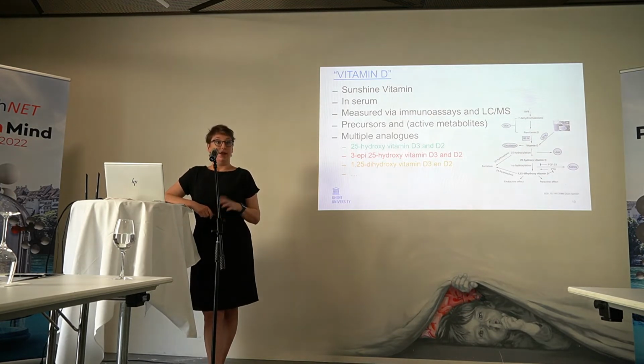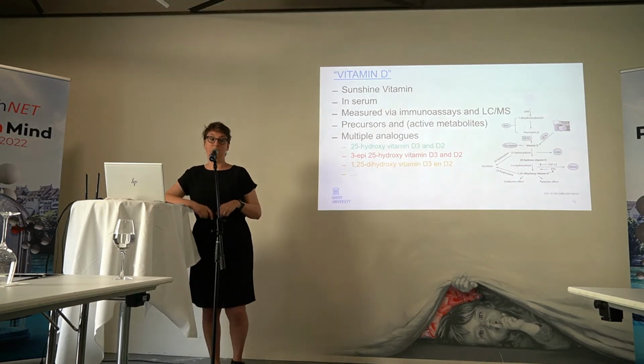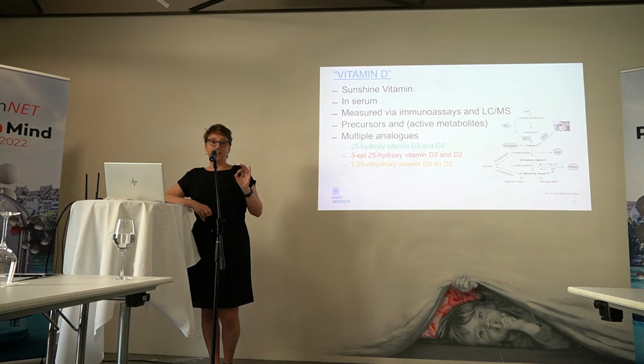There exist multiple analogs, just as for PET. We have the 25-hydroxyvitamin D3 and D2. I've put it in green because that's our clinically relevant measurement. That's what we measure. When your GP measures your vitamin D, he will measure, or let measure, the 25-hydroxyvitamin D3 and D2. The 3-epi 25-hydroxyvitamin D3 and D2, which is actually just a hydroxyl group which is flipped over, is not measured. It should not be measured.